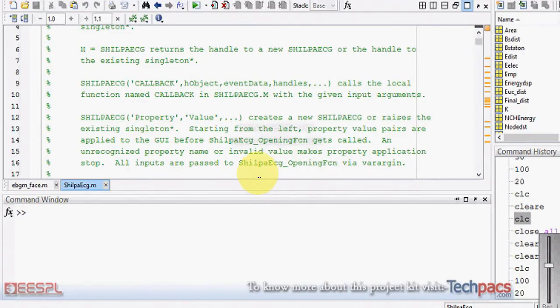This is Deepak from techpex.com. Today I'm here to present a system which will remove the noise from the ECG signal, which is a major issue these days for signal processing in the biomedical field.